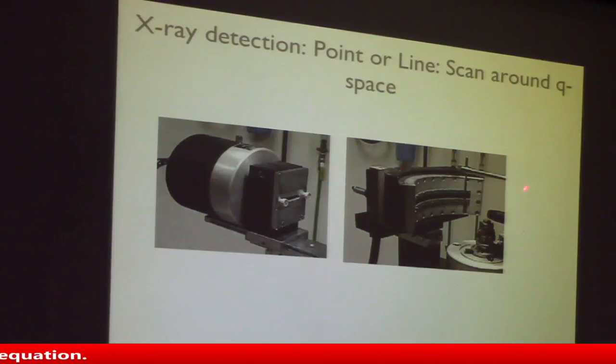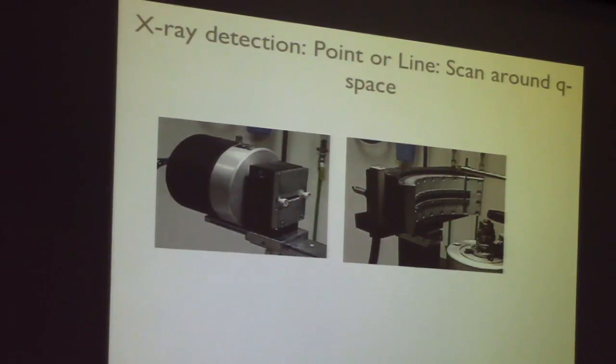So this is actually a photon counting detector. It counts individual photon events. If a single X-ray comes in, you get a single pulse of current, and you say, I detected an X-ray. This gives you some energy resolution because the size of the pulse depends on how energetic the X-ray was. And you can use electronics to gate it.